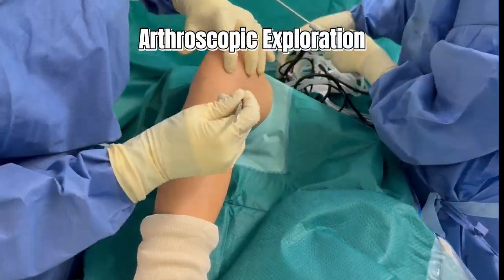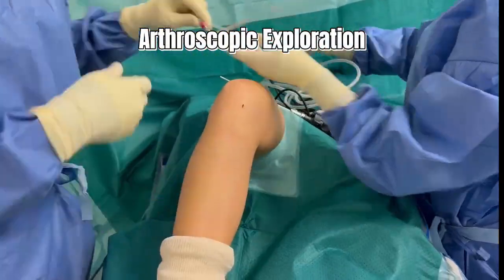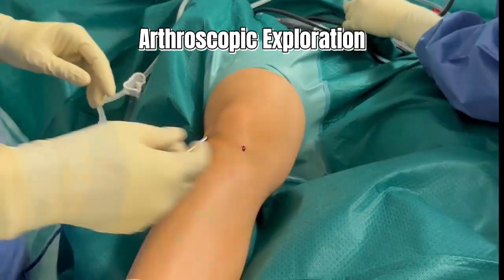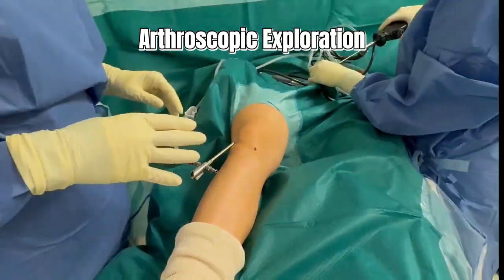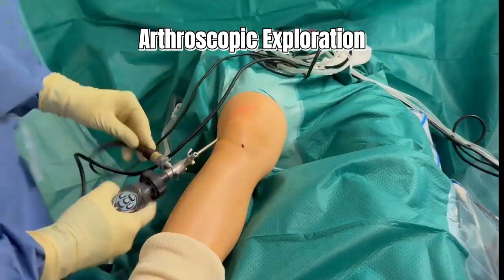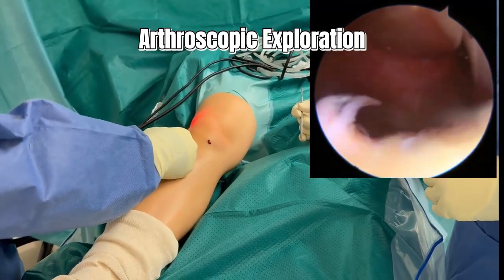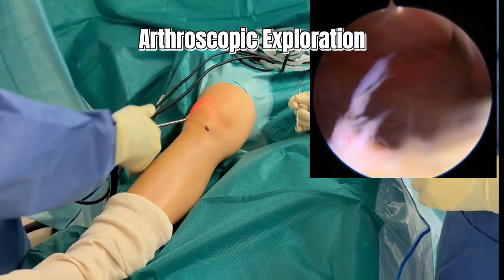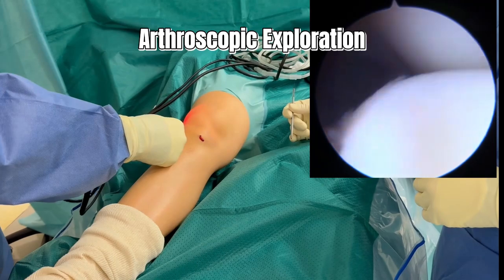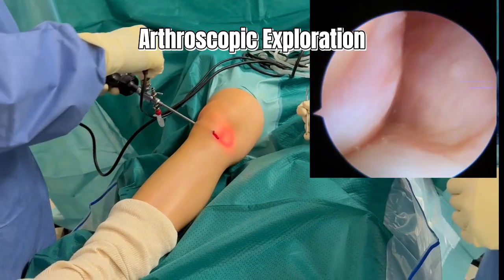Arthroscopic exploration is performed through standard anterolateral and anteromedial portals. Perform a dynamic exploration of the anterior compartments of the knee, starting with the suprapatellar region to the medial and lateral compartment of the knee.